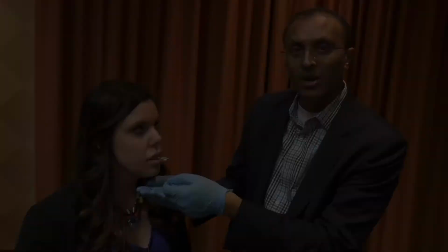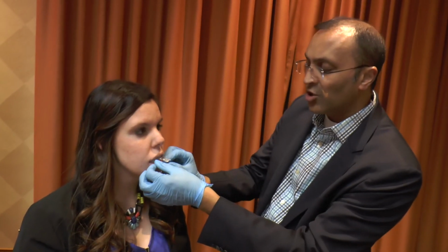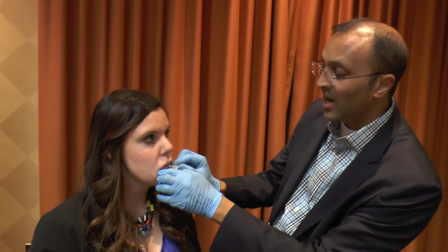This merely means that when the patient is sleeping, the bed partner can actually reach over and do 1 or 2 dials per day in an effort to assist with adjusting the device based on noise, specifically snoring. The note of caution here is to allow the patient to titrate this device till they are tolerable or there's resolution in their symptoms.